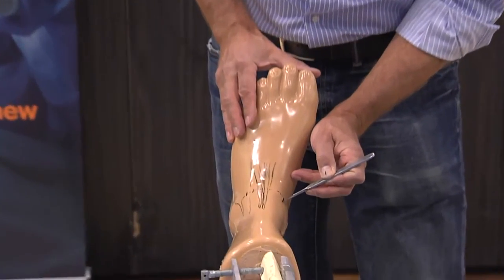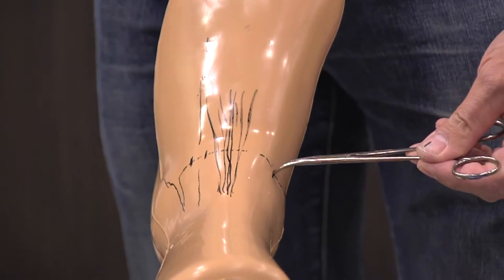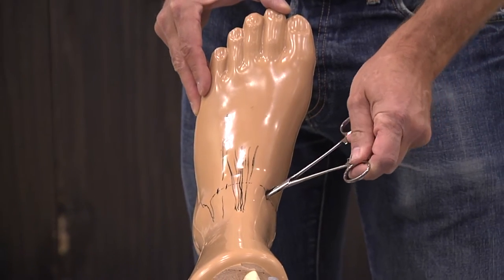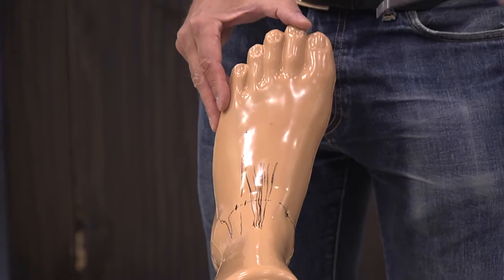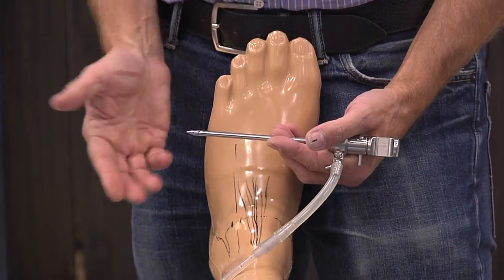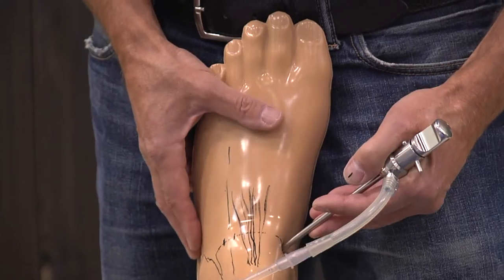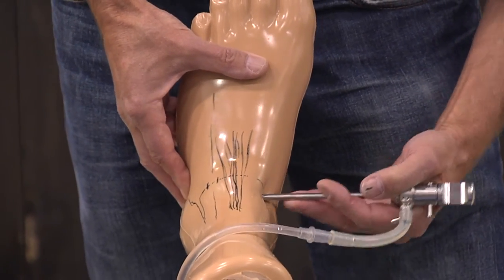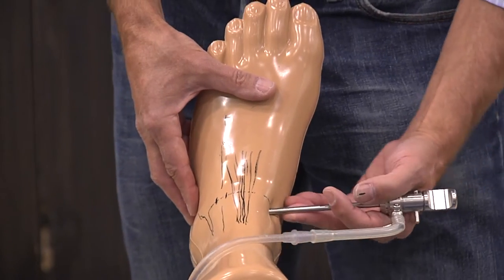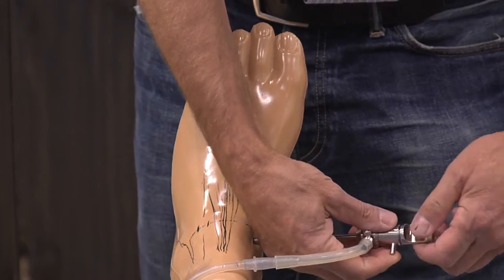Make the skin incision through the skin only. Then go in with your mosquito clamp — the direction is 90 degrees, go in like this to the bone, spread it, and that should be it. In the dorsiflexed position, then go in with your scope. I always use a 4mm scope — the same scope you use for the knee, it's perfect for the ankle. You go to the joint and then very gently glide in front. Hopefully I'm in the joint and you can make this motion because you have the joint capsule. Let's see what's inside.